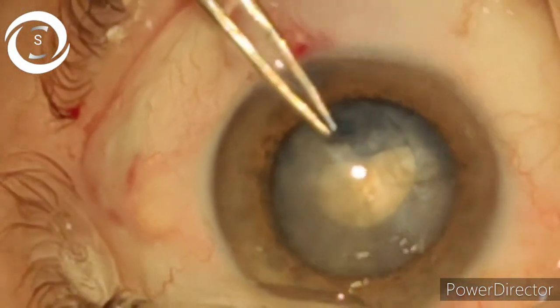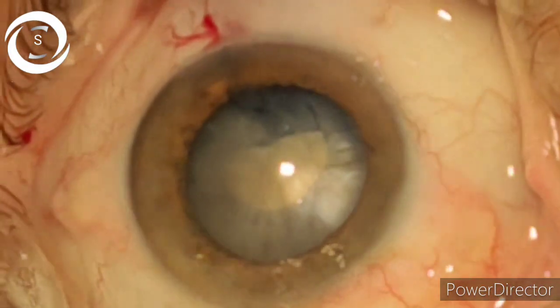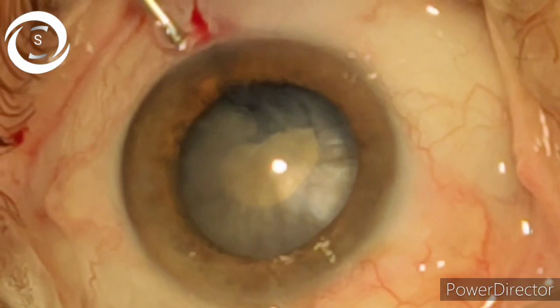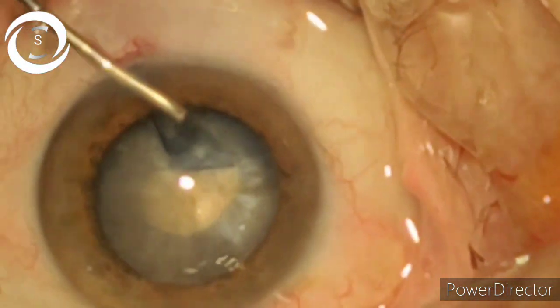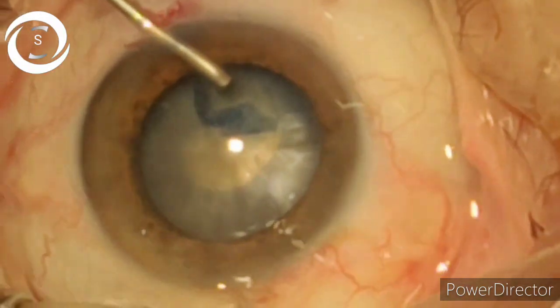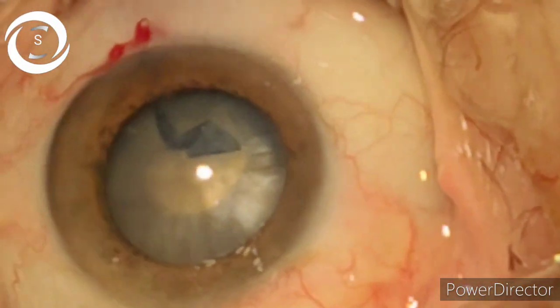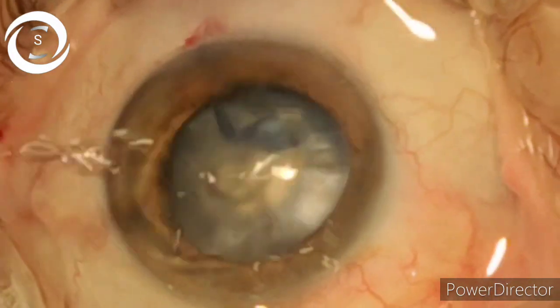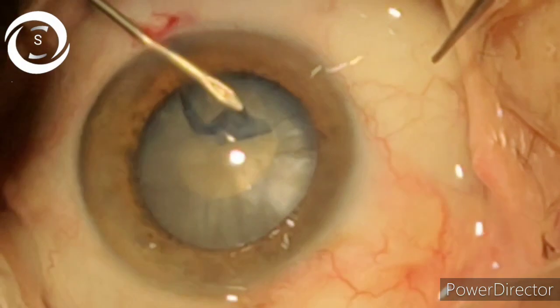We have two options here: first is to complete a small circle and then give a nick in the smaller circle and start a larger rhexis around it — I will show that technique another day. Today I will show the other technique, in which you start with a smaller circle and slowly and gradually enlarge it.